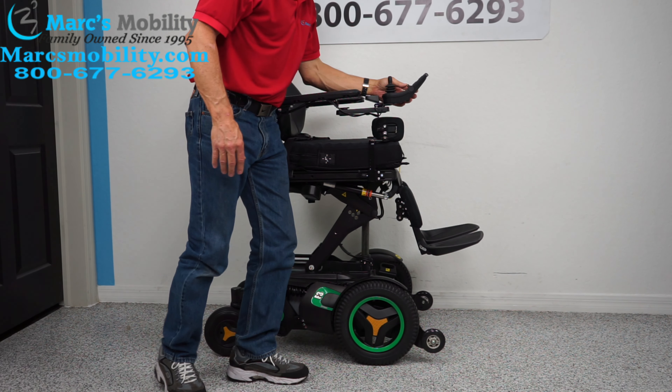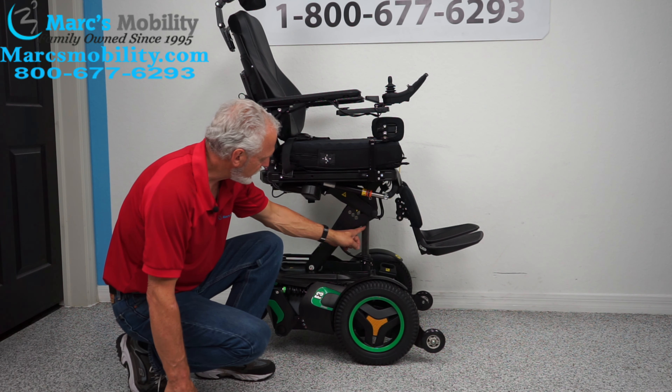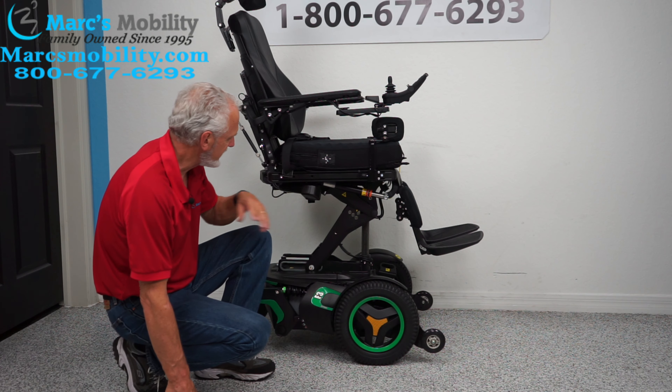We've covered the seat lift and the base. You can see the armature right here for the seat lift, and the actuator right here — that's the actuator. It makes the seat go up and down, tilt and recline, all kinds of stuff.